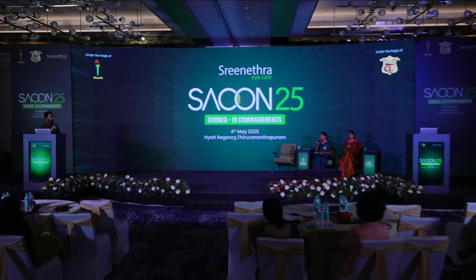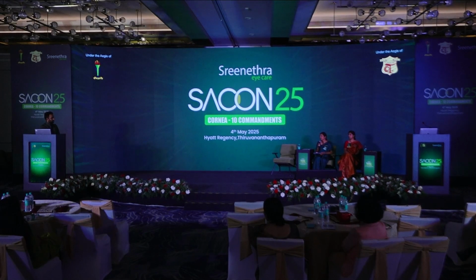No, in epi-on, you really don't look at the minimum thickness because you are preserving the epithelium. That's one of the advantages. The main advantage is that you don't have that scarring. The cornea doesn't flatten uncontrollably. Sometimes in the epi-off C3R corneas, you see even after 5 years, they continue to flatten. You don't see that with epi-on. So that's the main reason why I prefer that.